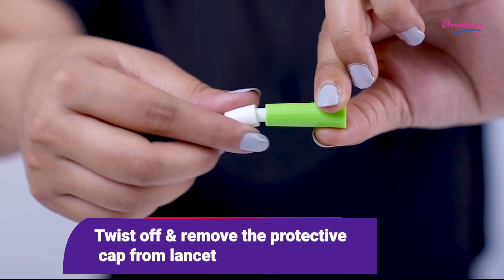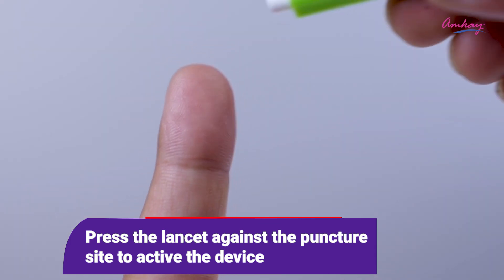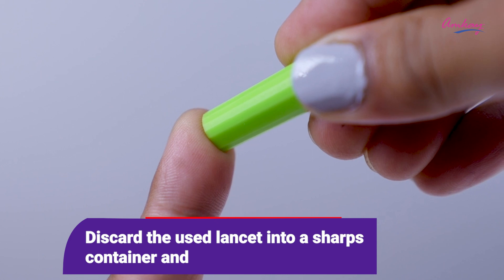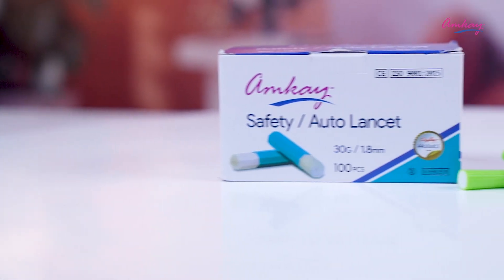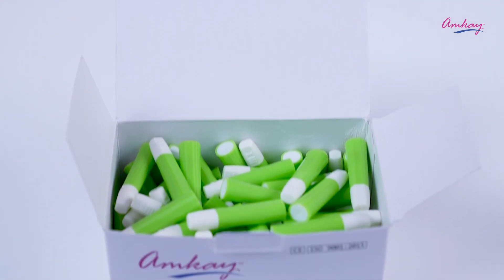Now let's see how to use this lancet. Twist off and remove the protective cap from the lancet. Press the lancet against the puncture site to activate the device. Discard the lancet into a sharps container and gently press the puncture site to obtain the required blood volume. This portable device is easy to use and you can carry it anytime, anywhere.